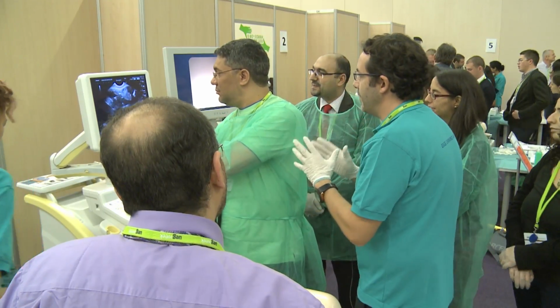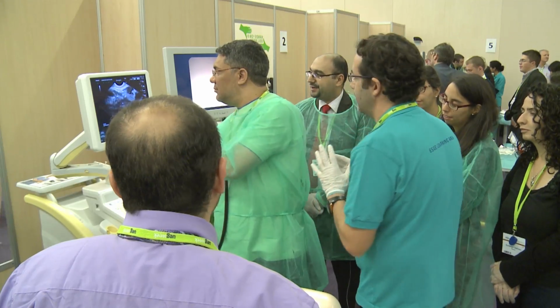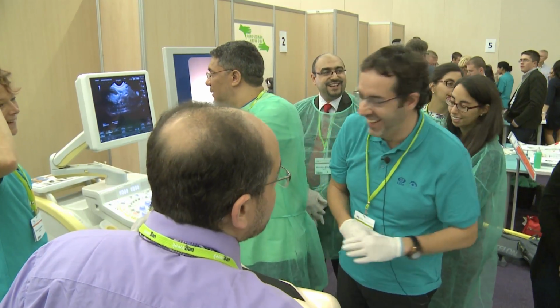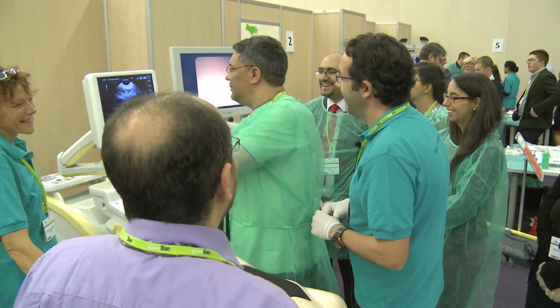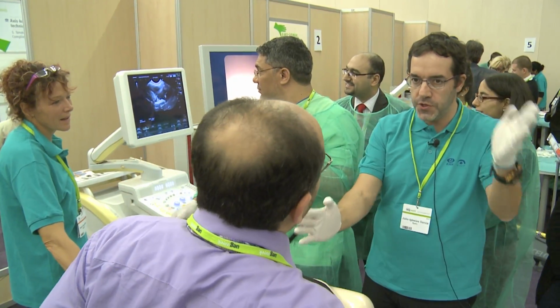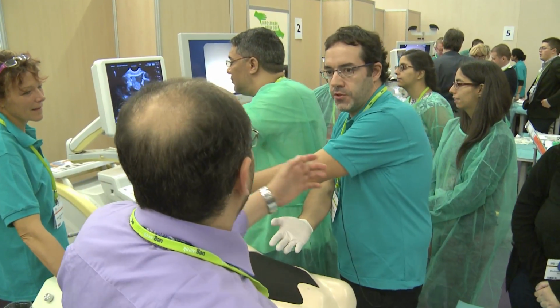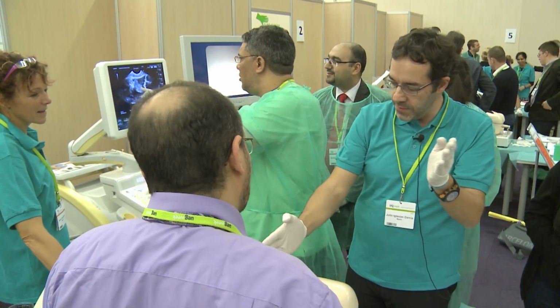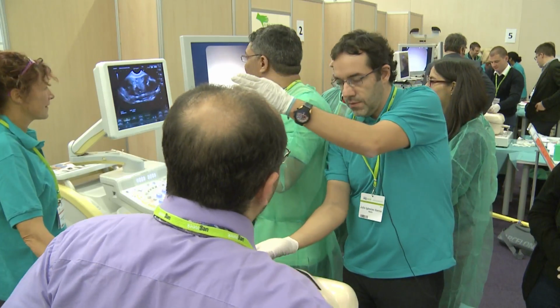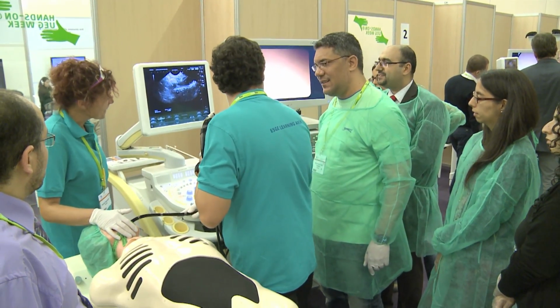And this is even more clear in patients. Dr. Martinez Alcala, am I correct or not? So we don't do the close position? No, never. I go always from this position to this position. And with this management, you are always going to have the scope straight. So this is the endoscopic approach.